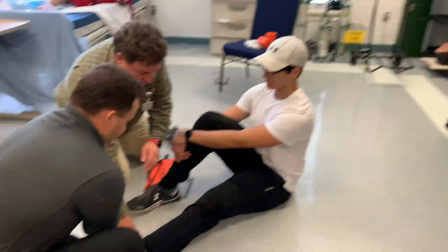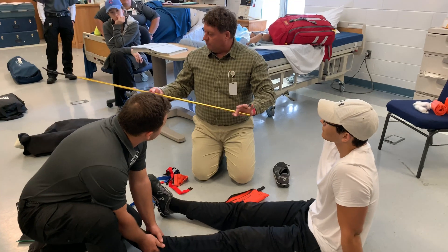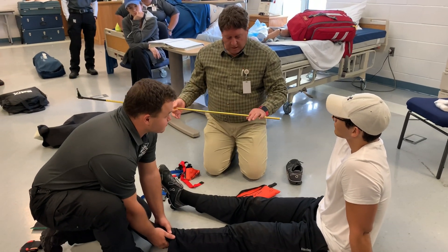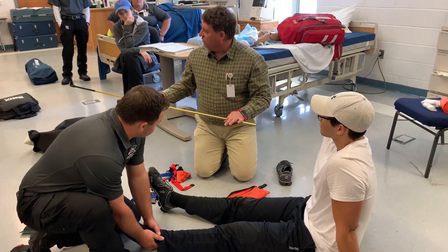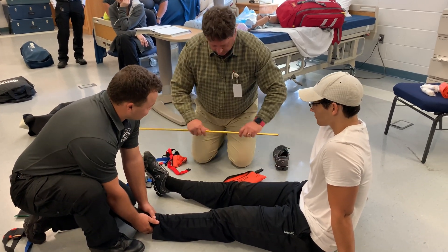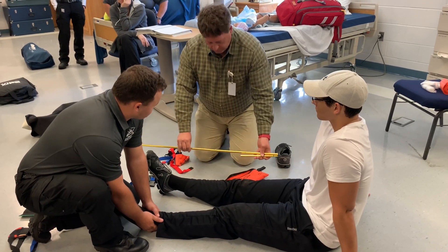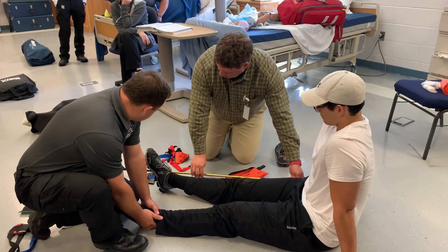Now what I do like about this is the pole part of it — it is going to go up against the leg. I can measure it on the uninjured side and figure out about how long I need it, and it's usually better to go too long than not long enough. So I'm going to say that's about right.